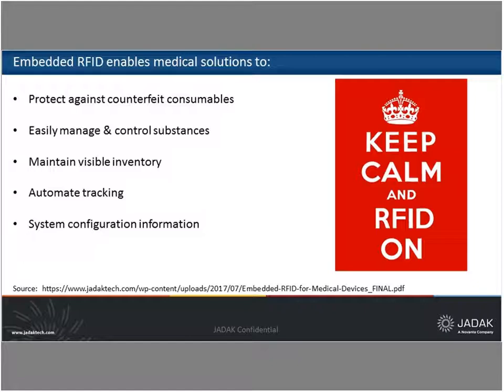And then track. Part of this means adherence to guidelines for workflow process and just making sure that the products are used as the device manufacturer specifies them to be used, which includes verification of lot IDs, expiration dates, directions and configurations for the device, so that the RFID tags can actually provide configuration for the particular reagents or cartridges that are used in the device and help in the setup.